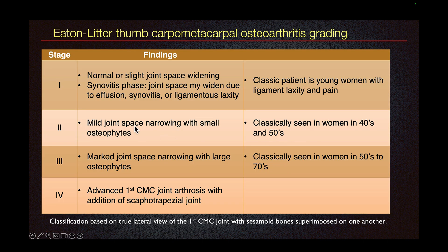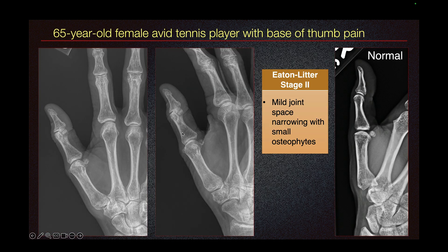In stage 2, there is mild joint space narrowing with small osteophytes. This is not a dedicated thumb series, but we can see that there is mild joint space narrowing and there is a small osteophyte. So this would be Eaton-Littler stage 2 in our 65-year-old female tennis player with base of thumb pain.